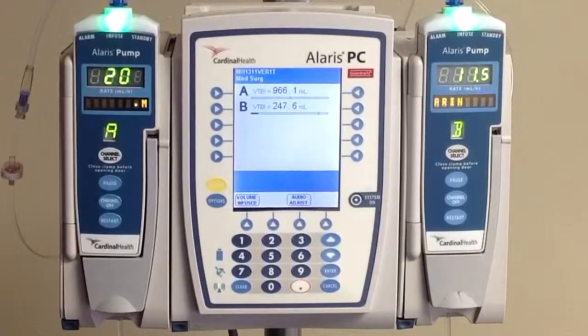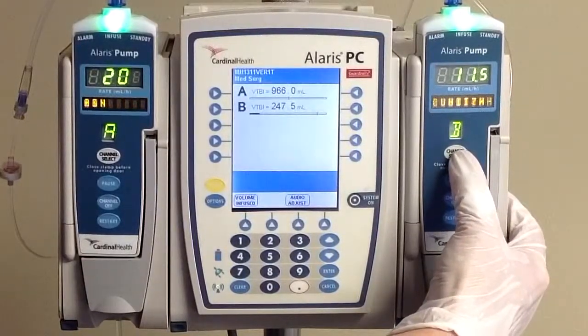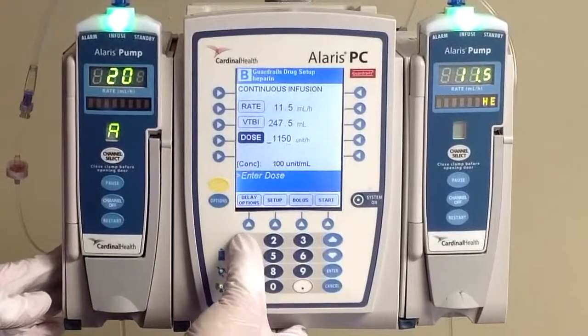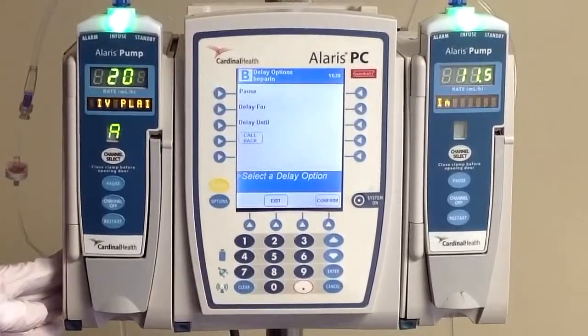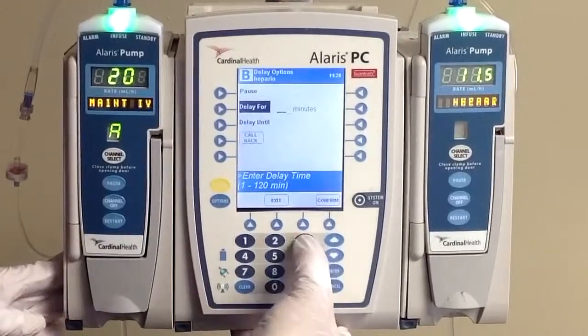Fast forward six hours in our scenario. Our result is back for our heparin level, and it is now 1.04. Based on our order, that means we're going to have to change our rate down another 100 units, and we're going to hold our infusion for 30 minutes. Start by doing channel select. You're going to change your dose from 1,150 to 1,050, which will automatically calculate our rate for us. Now we're going to use the delay options button in order to stop our pump for 30 minutes, using the delay for option within here. Go ahead and type in 30 minutes.